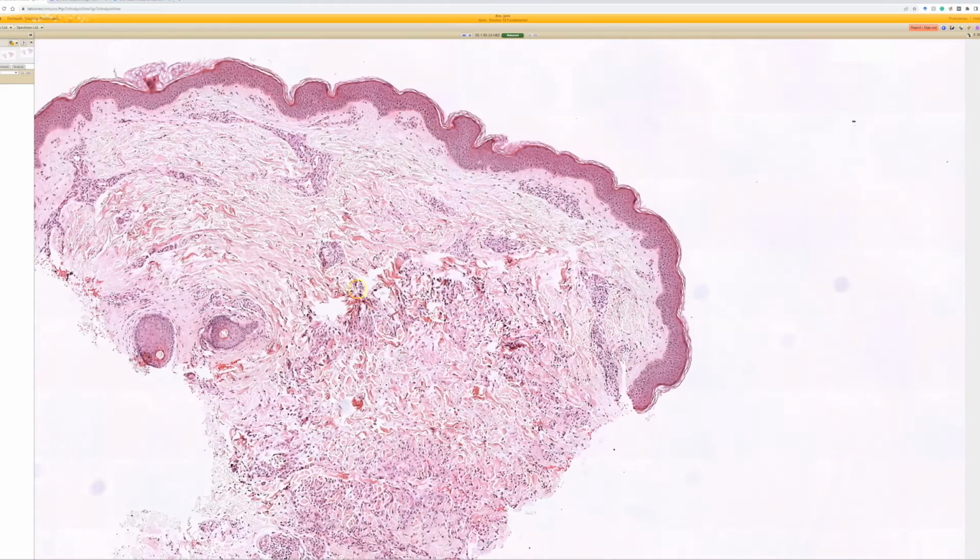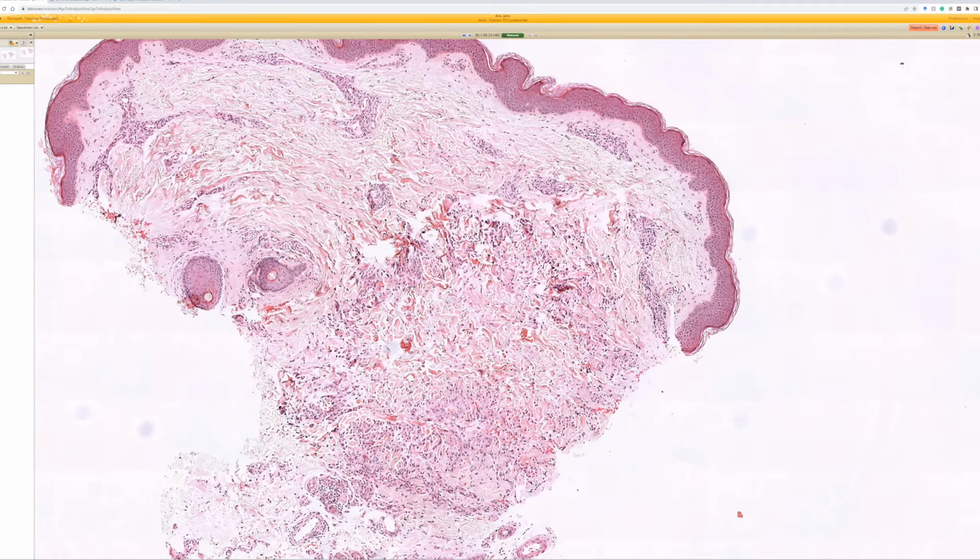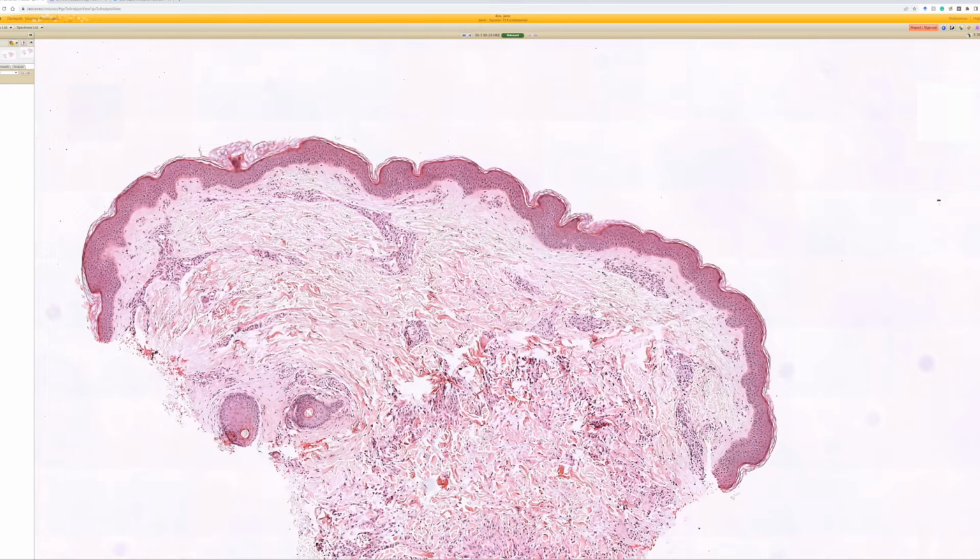Okay, the final thing I got distracted from at the beginning, apologies for that, is that I said GA is annular or ring-shaped microscopically usually, and also usually clinically. Clinically, GA presents as ring-shaped lesions. I did mention that, and so it's important to remember that sometimes it will get confused with other things that are annular and ring-shaped, like dermatophyte fungal infection or tinea, sometimes known as ringworm outside of dermatology circles and to the non-medical public, okay? So those can be ring-shaped, usually more scaly and less indurated, but that's another thing.